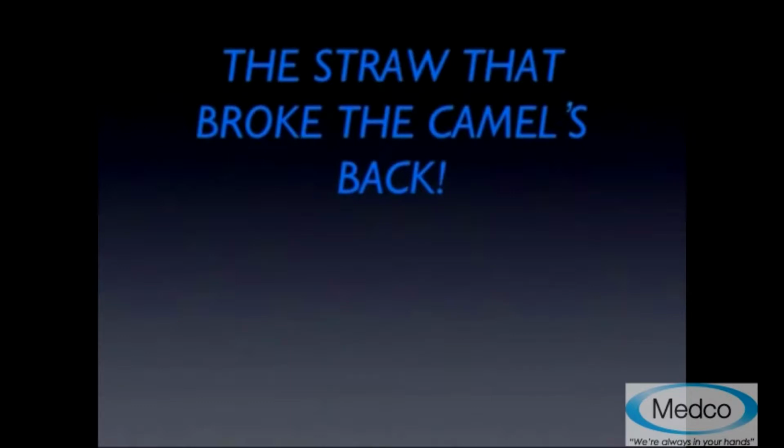And really this dates back to a case I treated early on with an active surface or an enhanced surface. When I first got these implants, I was told by the company that at 4 weeks you could place an abutment and torque it to 35 Newton centimeters. Well, the problem we find in practice is that the patients don't seem to read the books that are handed to us as clinicians. They don't seem to follow directions the way they're supposed to always biologically heal.